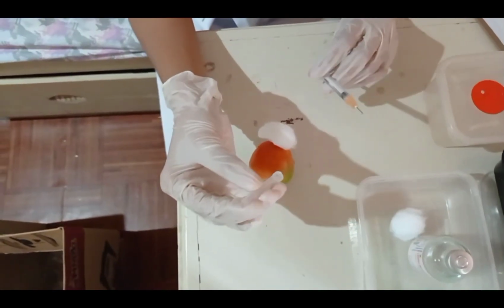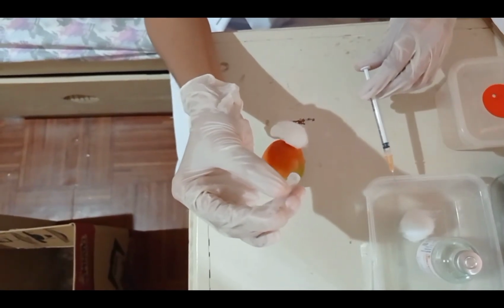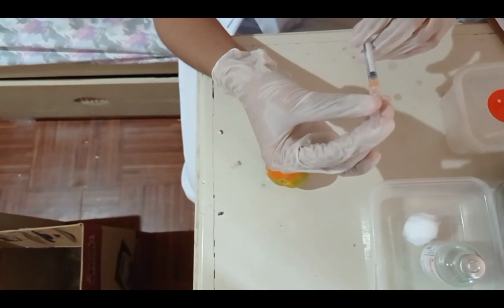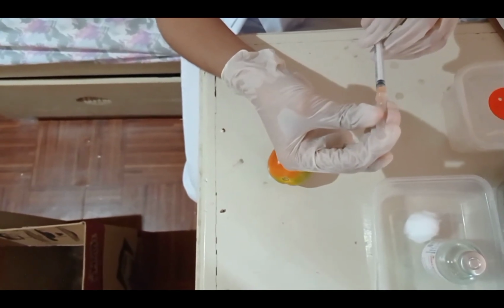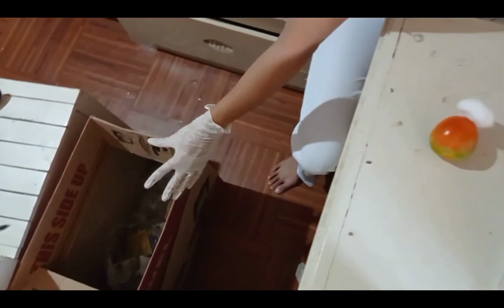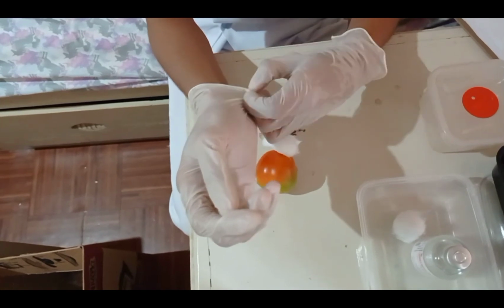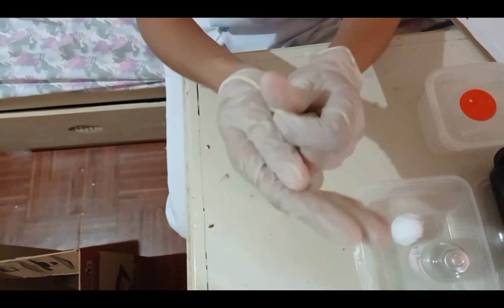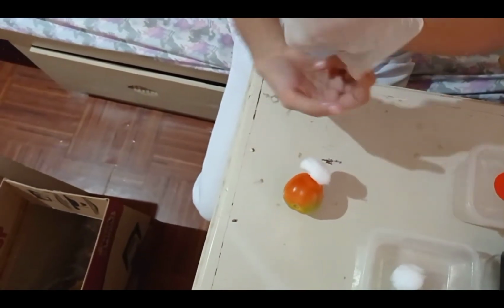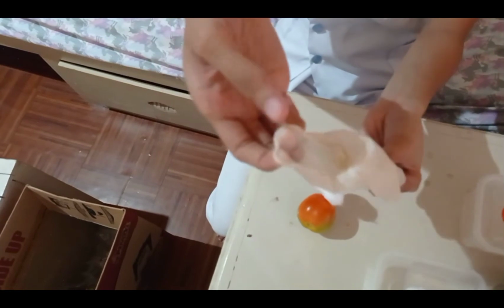Recap the needle, and before discarding it, we should apply the safety shield or the cap to guard the needle and dispose of it in the sharps container. Then, we also discard the remaining supplies that we used, such as the gloves and the vaccine vial.